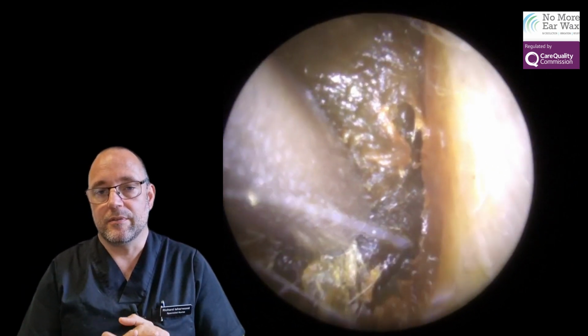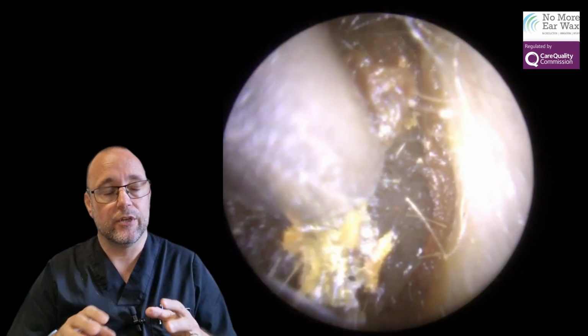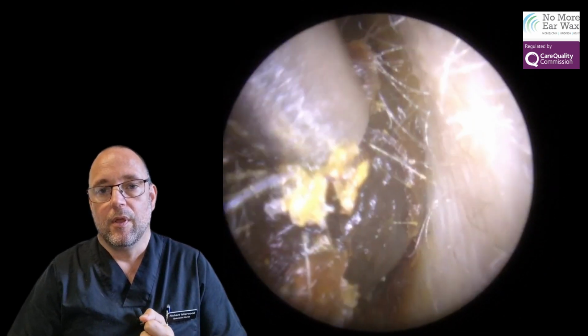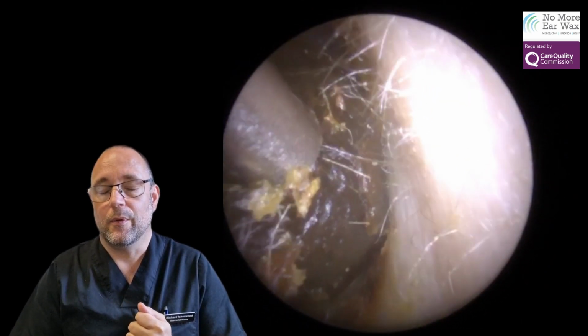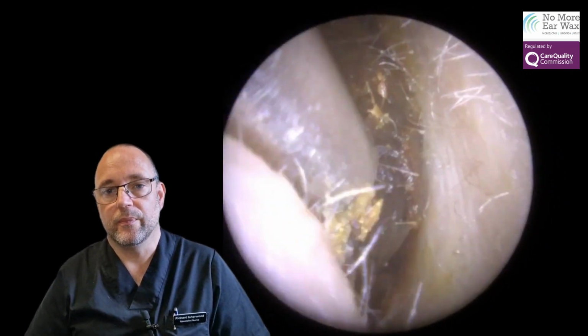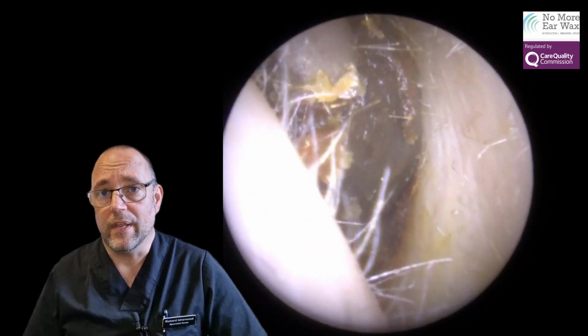So this one, the other one we had to irrigate because what he'd done, he'd oiled it. Well, he'd not oiled it. He'd put hydrogen peroxide drops in there. Whilst there's a time and a place for that, what it tends to do is turn it into a big sloppy, gooey mess, which doesn't make it impossible to suction. It's just a lot quicker to irrigate.